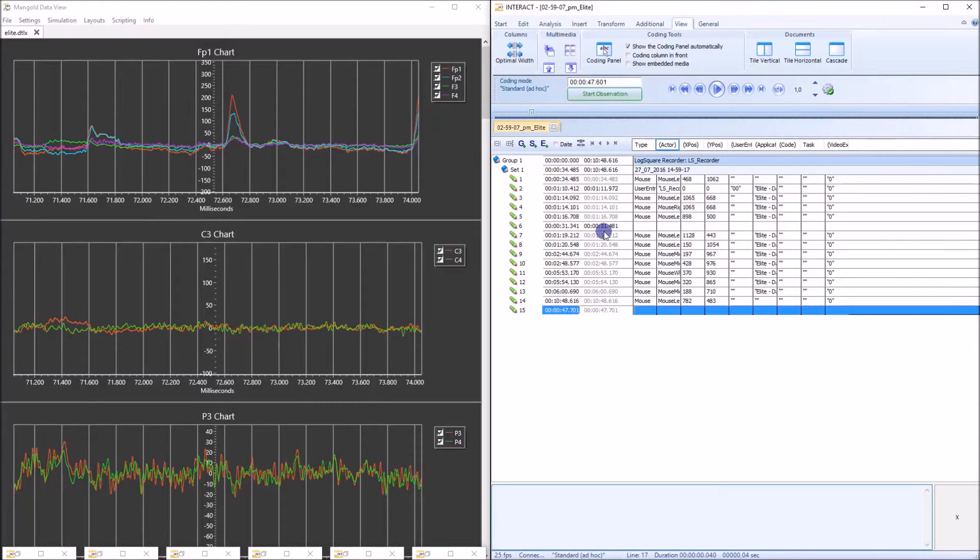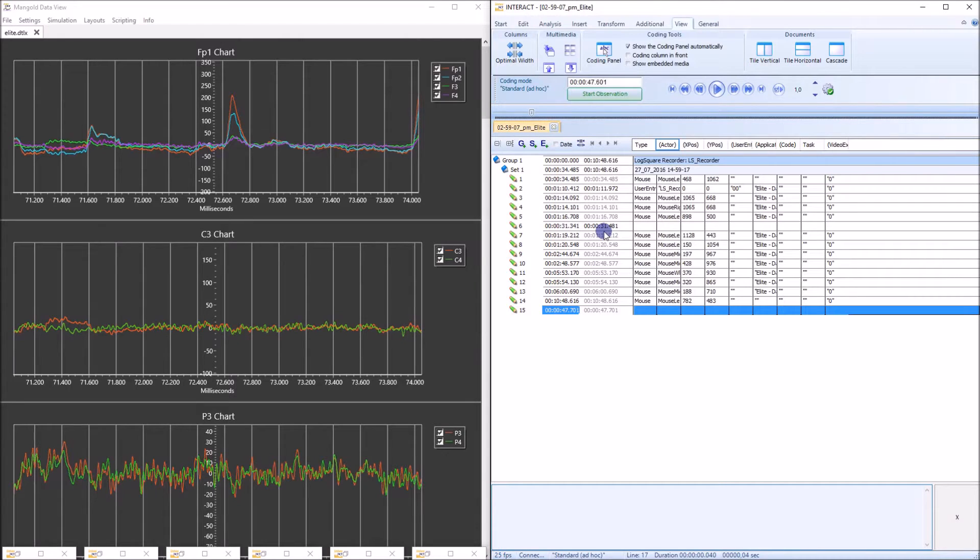Hi, I want to show you a proof of synchronicity between the EEG data and the video data that were recorded through VideoSync Pro.